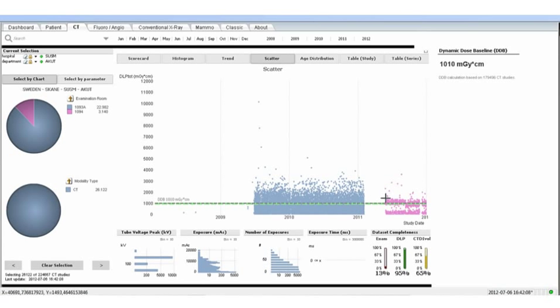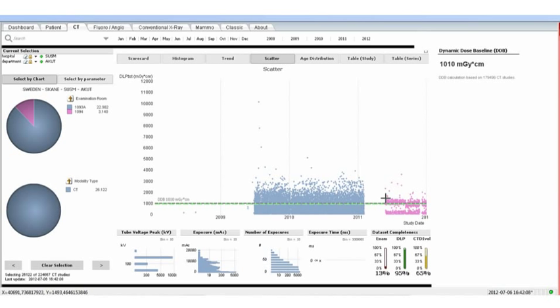The second scanner, commissioned mid-2011, has a completely different and much lower dose profile than the original, and this is very clearly presented by the system.